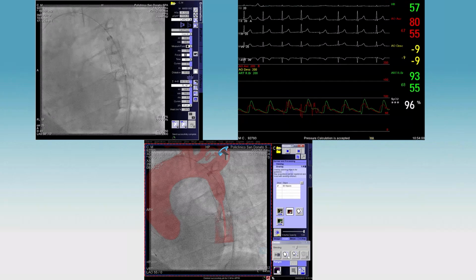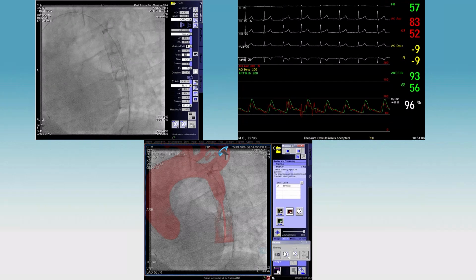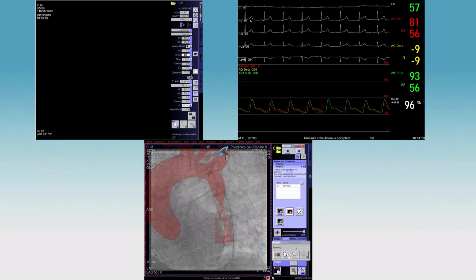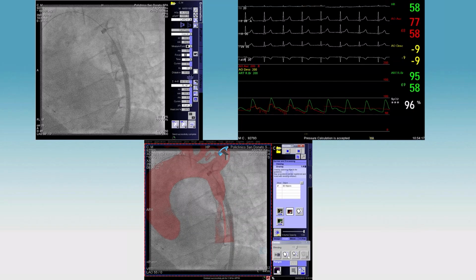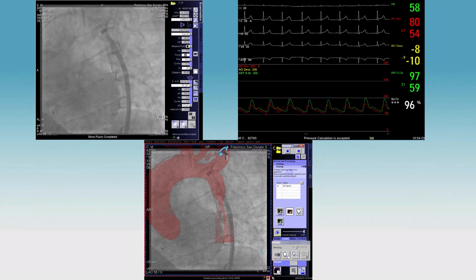So just going to do a check angio before we pull the balloon out, and see whether we need to redilate a bit more or not. An acquisition, if you could. Acquire, yes. Okay, go. Good.